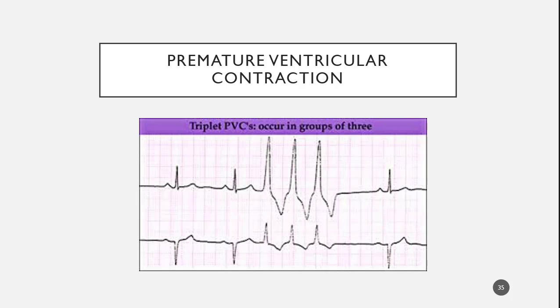It's hard to say if it's ventricular or junctional. These three in here — you might be able to make an argument that these are not ventricular. You look at the width of the QRS complexes. We can't really tell because we don't have a scale there, but if it's ventricular, it's got to be wider than 0.12 seconds.